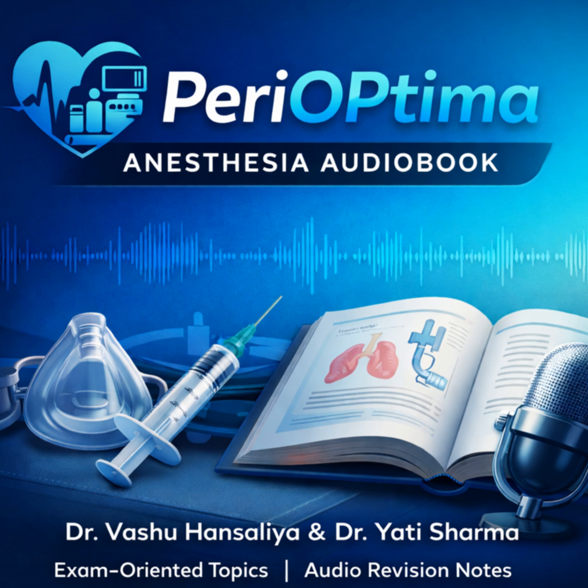Let's talk complications then. What's the most common one? The most common major complication is limb ischemia. The catheter is large, 7.5 or 8 French. In a small or diseased vessel, that's like putting a cork in a bottle. So you have to constantly check the leg. You must monitor distal pulses constantly. Other complications include thrombocytopenia, the balloon physically smashes platelets, and hemolysis, and mechanically, the balloon can rupture, causing that gas embolus we talked about, or the catheter can get entrapped.